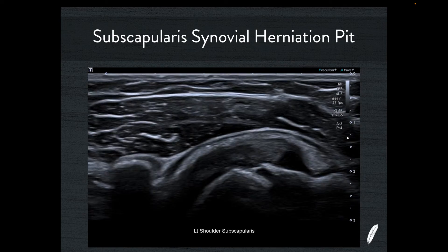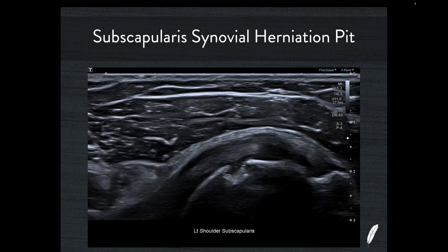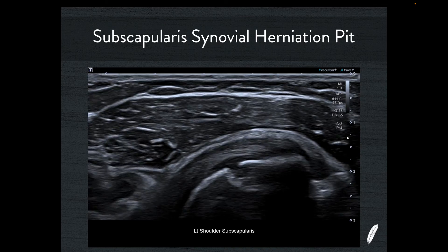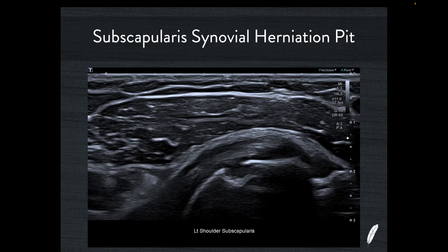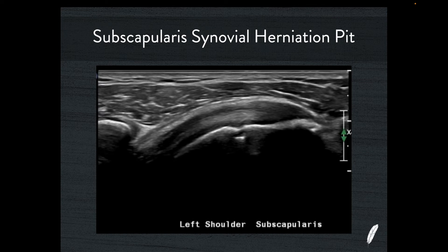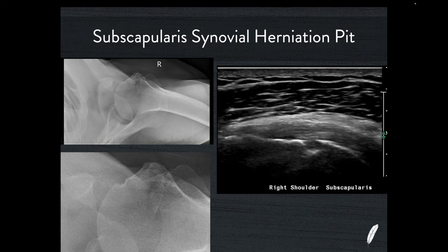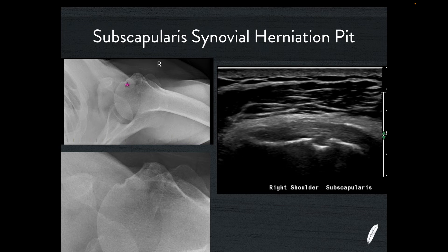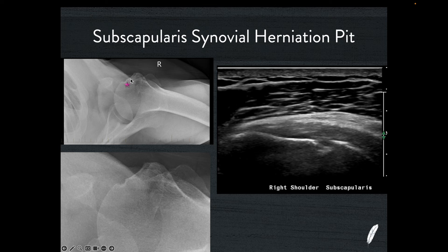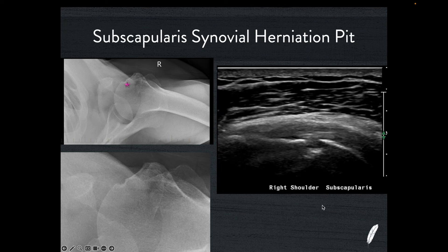We're going to see these in multiple locations when we do shoulder ultrasound. A very common location is the subscapularis tendon in the long axis — you very commonly see these little synovial herniation pits just where the hyaline cartilage finishes and the enthesis begins. If we were to call all of these tears, then so many patients would have a tear of the subscapularis, and this is not the usual location of a subscapularis tear. They're almost ubiquitous in this location — you see them day in, day out. On plain x-ray you can see this little niche in the bone — the little synovial herniation pit — just at the end of the hyaline cartilage, right where the enthesis for the subscapularis begins.